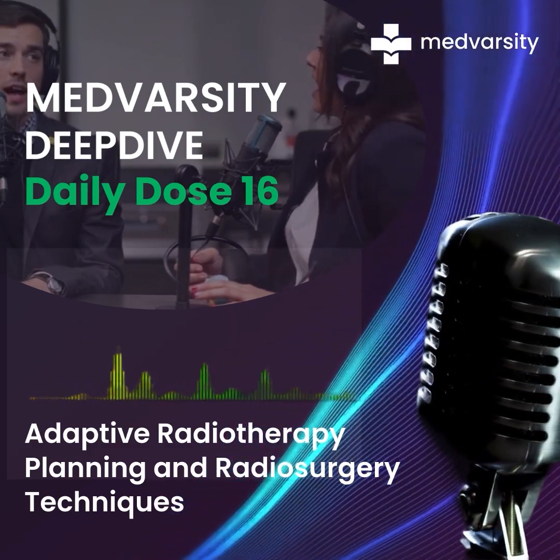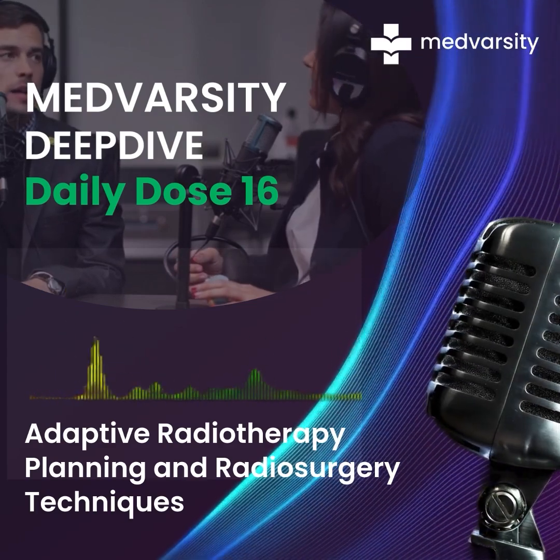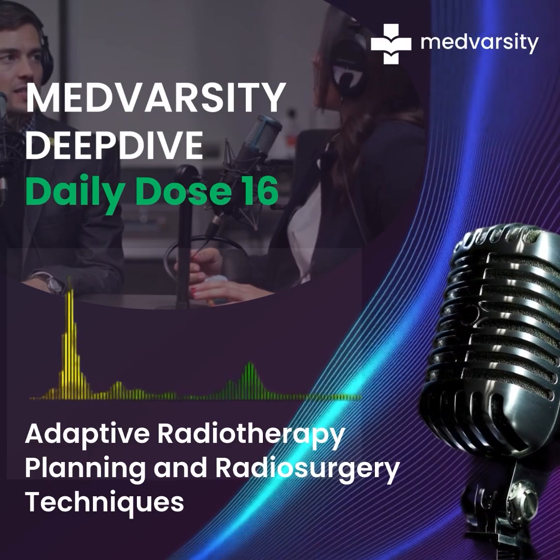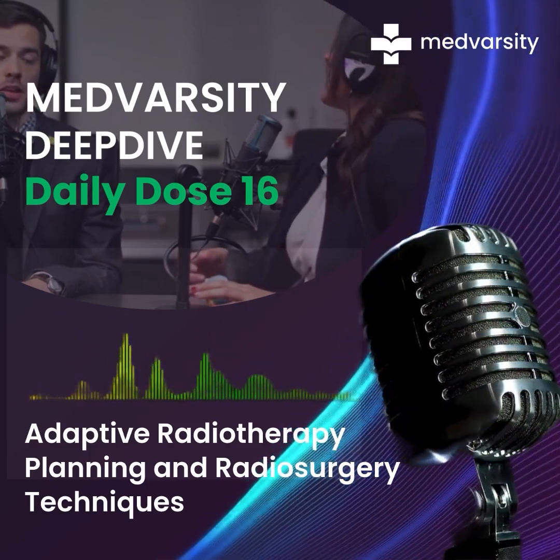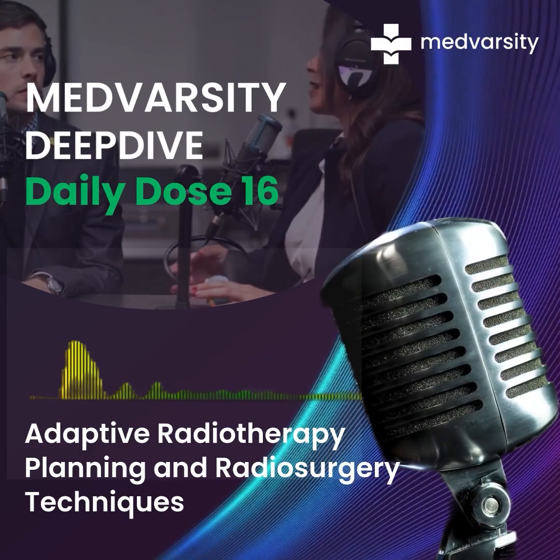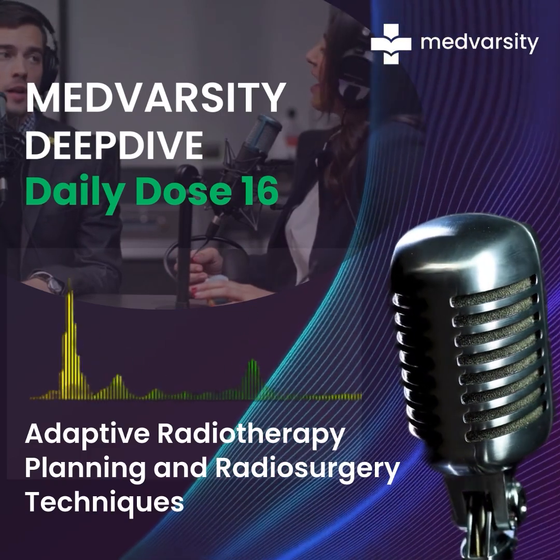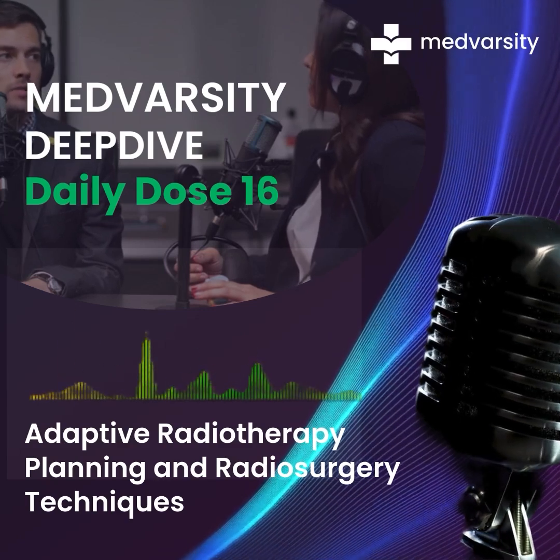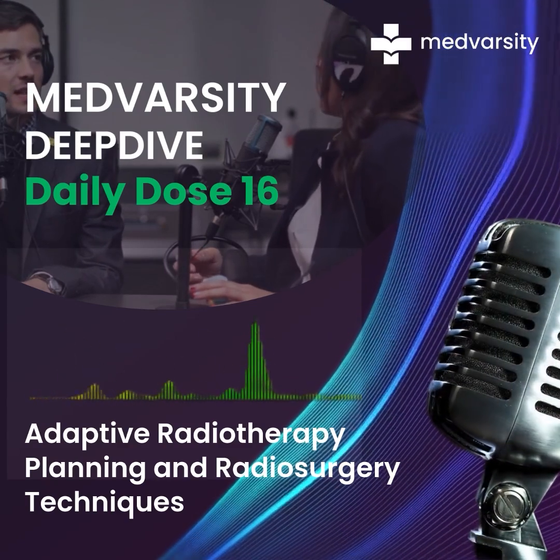And that flexibility is really key because CyberKnife can track tumor motion in real time. So if that tumor is in an area that moves when you breathe or with other bodily functions, it can really make sure that we're staying on target. So it's like having a robotic surgeon that's constantly adjusting to hit that moving target. Exactly. So it uses something called a 6D robotic couch, which means it can move in 6 different directions. Wow. And it combines real-time imaging with beam delivery from thousands of different angles. So it's not just tracking the tumor, it's also adjusting the angle of the radiation to make sure it's hitting the tumor in the best possible way.